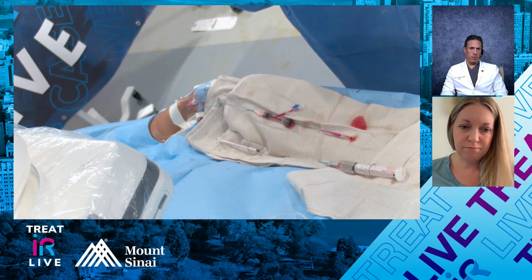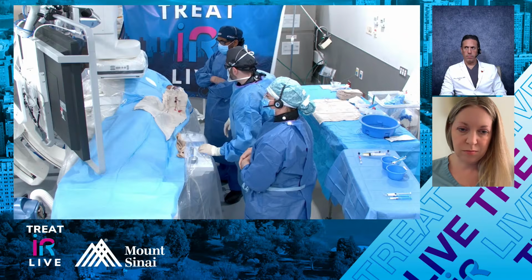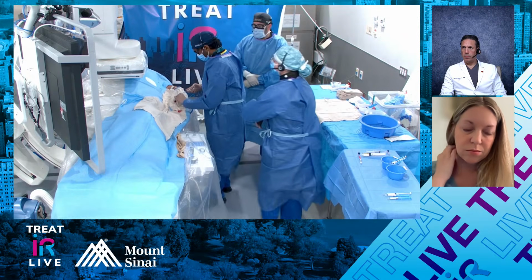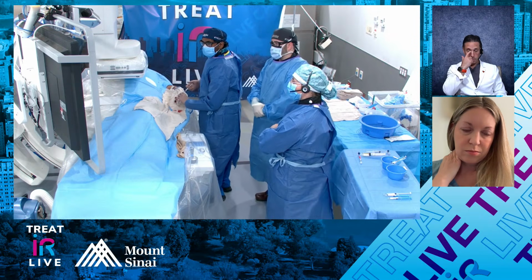Do you guys want to show us the angiograms and show us what you've done so far? We're going to have to go back. I'm not sure we're going to be able to show the initial run. We had a little bit of a technical error as we changed things, but we can definitely show a DSA of where we are now. We selected the IMA by radial, and then Jay expertly navigated to exactly where we want to be. So he's going to show you exactly where we are now.